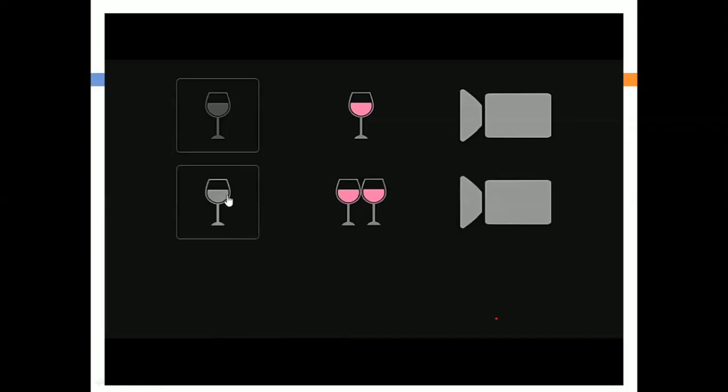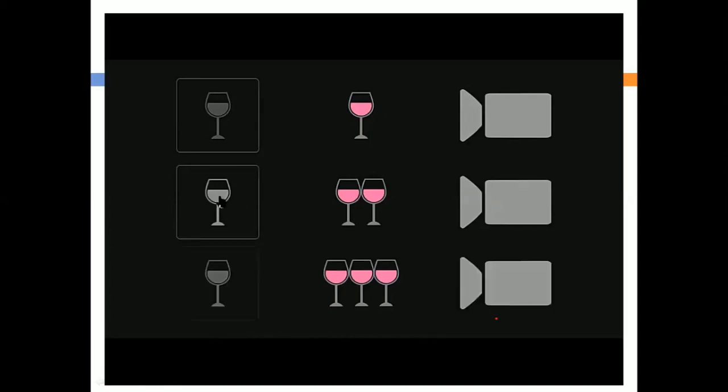And instead of one glass, if you take 2 glasses of juice or 2 glasses of wine, and you pass the X-rays through the glass, what happens here? As the thickness is more, you'll be having somewhat whitish color. So this one, there is a little resistance, so you're seeing a black color image like the lungs, and this one you are seeing somewhat white color because of your shoulder bones, and this one the thickness is more here, because of which you are observing the white color.